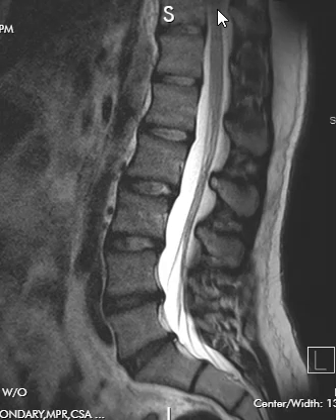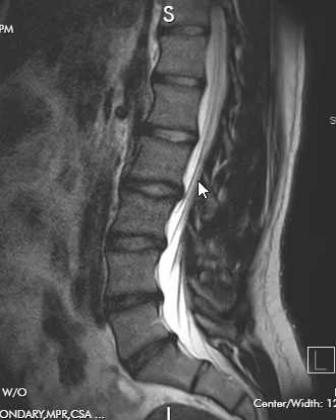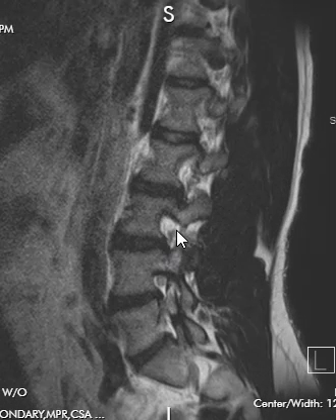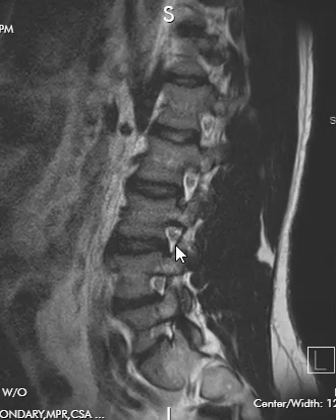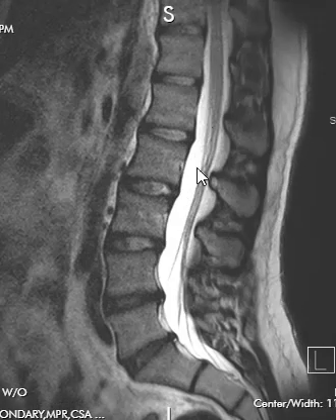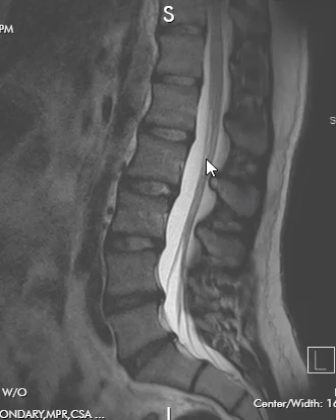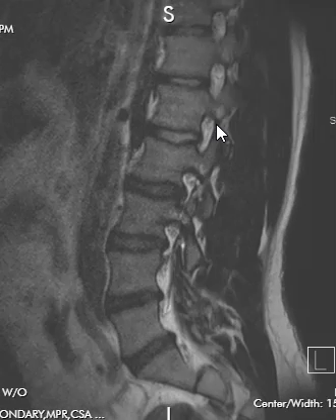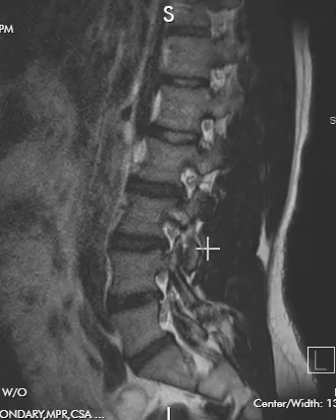Within the spinal canal we see a dark area — this is the spinal cord. It comes down and ends about right here, then gives off little nerves that come down like spaghetti. At each disc level there's a hole called a foramen, and within the foramen you see a single nerve passing through. Our job is to look at the central spinal canal, make sure it's filled with white fluid and open, check that the nerves look normal with no tumors or abnormalities. Then we roll off to the right and left to check that the foramina are open.